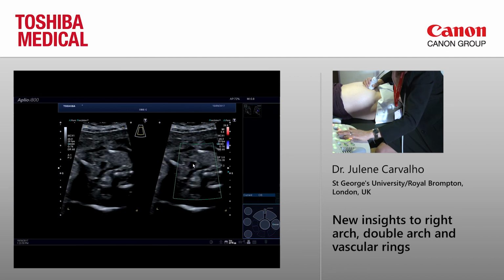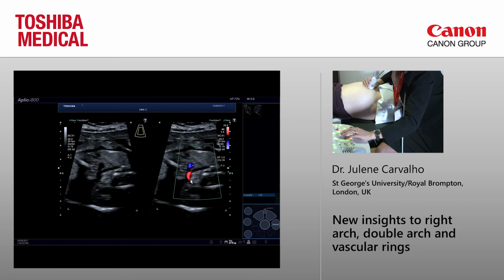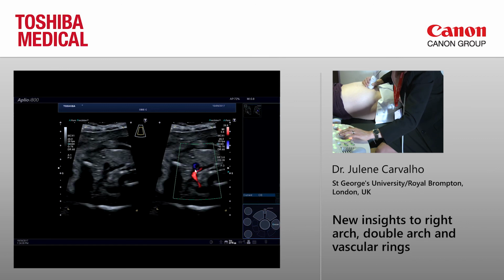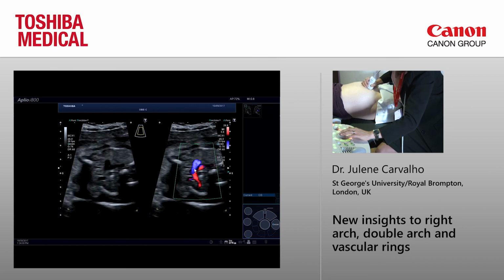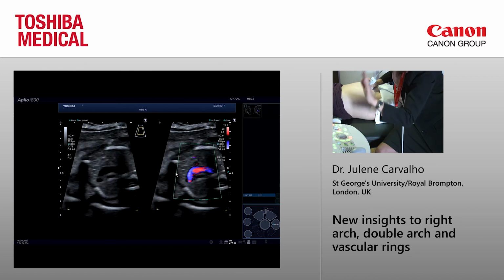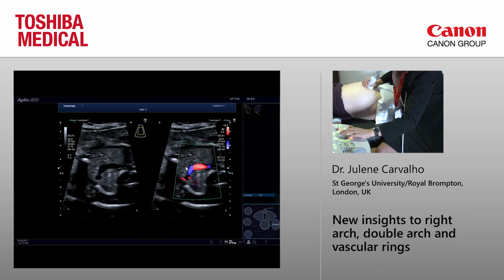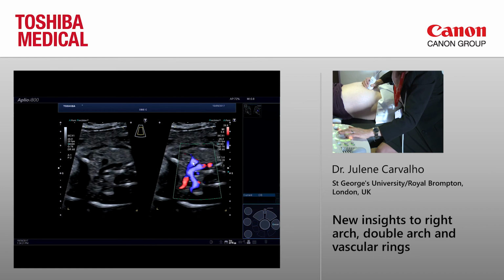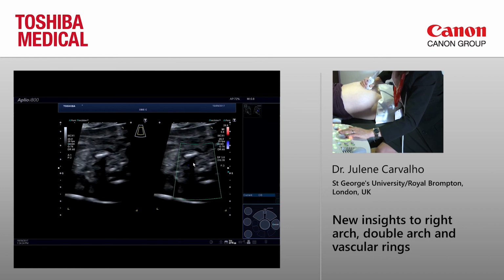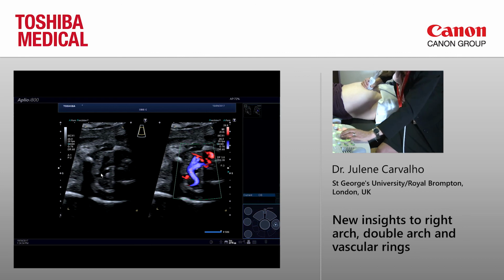Can you see here? It's a vein. The two things here. This is the aortic arch with the branching, the subclavian, another subclavian, and in front here is a venous signal, yeah? Very close. It usually is above the aortic arch. Sometimes it can be quite curved here, almost as if it's within the thymus. Can you see that? I'm just undulating a little bit. There. This is the innominate vein. Yeah? You can see it here as well. And we will join the SVC, yeah?